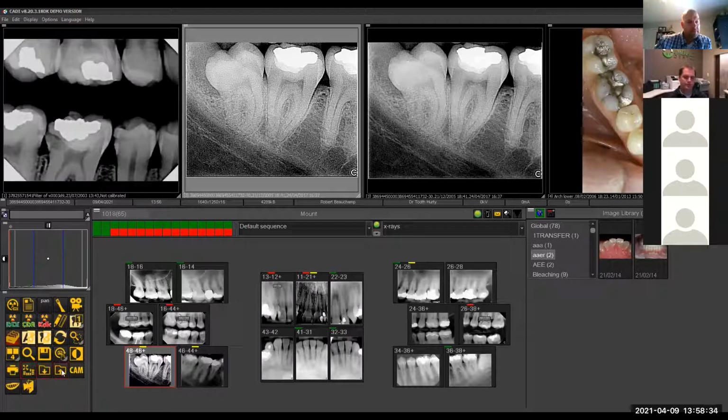After that, we will continue with the hardware setup for the panel machine and the sensors and the bridge as well. As far as the training goes, I will be stepping out for about an hour, and then I'll come back to you. Is that okay with you? Oh yeah, absolutely. Okay, for sure. I'm still going to be monitoring the server. Like I said, it's about 60%, so it should be done in an hour. Then around 12 p.m. my time, which is, I believe, 3 p.m. your time, I will come back to the call, and hopefully it's done by then, so we can set up the hardware and the sensors, and then the bridge for the practice management.